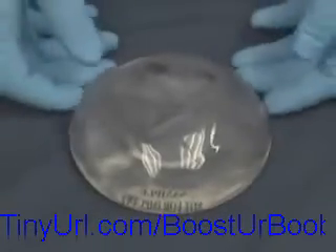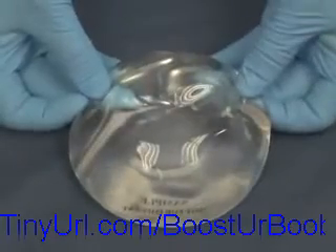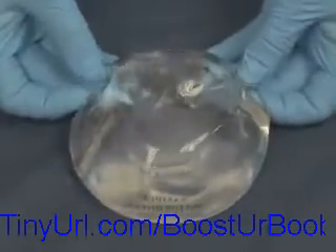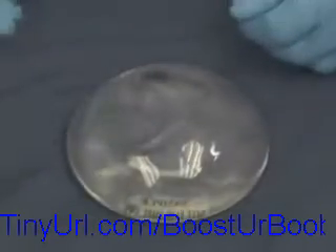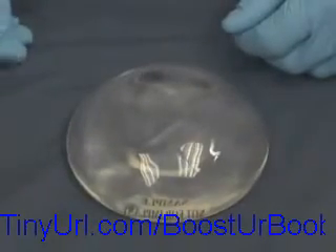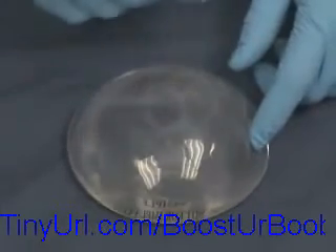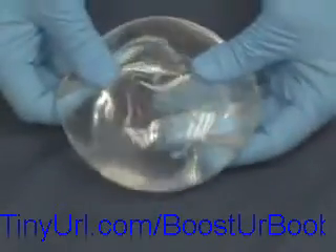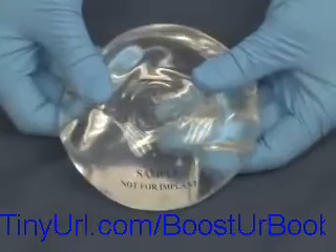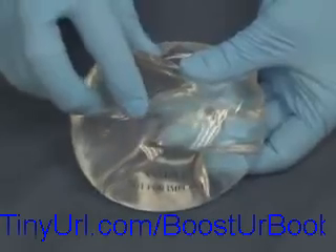This is the new generation of silicone gel implant — these are cohesive gel, or sometimes called gummy bear implants, because the inner contents, while still soft, are thicker than the old-style silicone implants. If the shell is cut and the implant loses its integrity, the gel doesn't run all over the place. This particular implant is a sample, not for implantation in live patients — it is for demonstration purposes only.